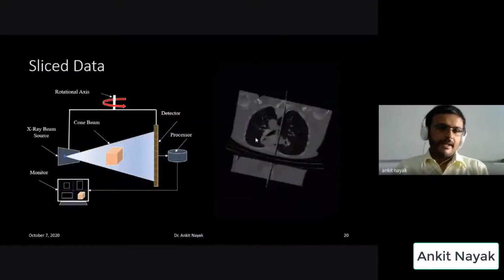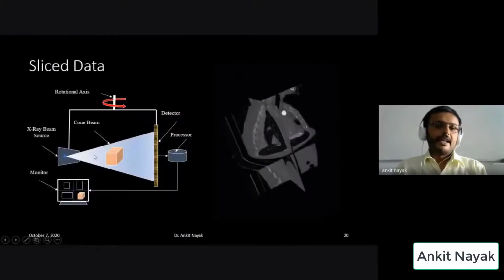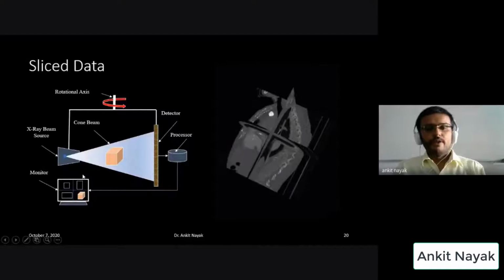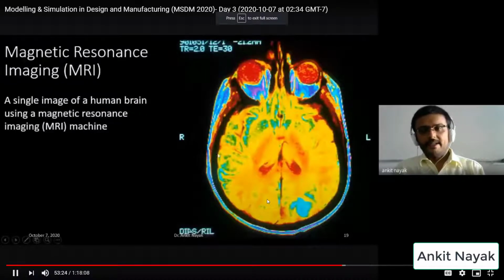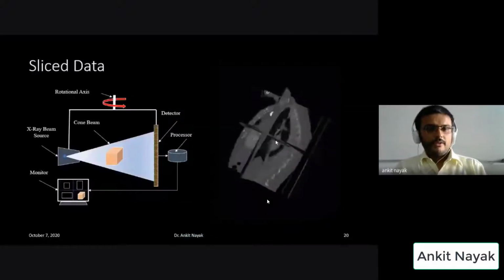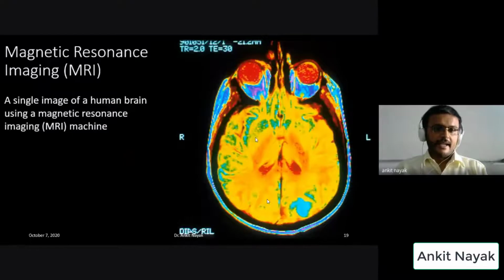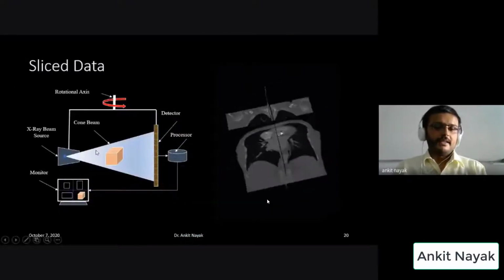So the first thing we require is slice data, which we can gather from the CT scanning.